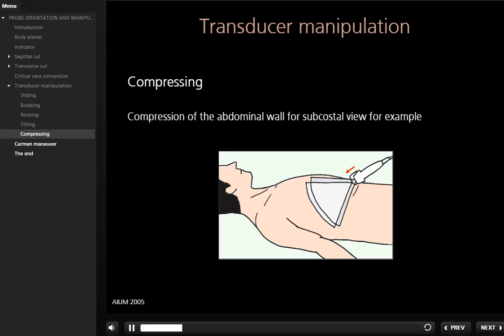This slide shows compression being used for subcostal view. When doing this manipulation, always consider the patient's discomfort level.